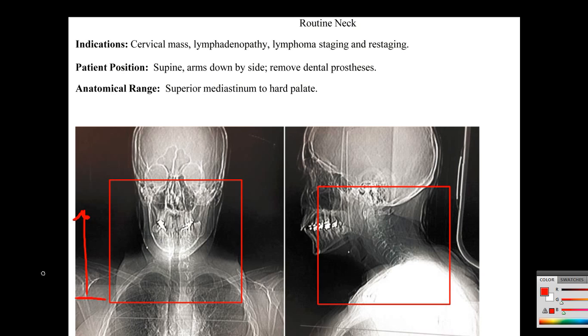The reason for this is because, as you'll remember, in the aortic arch, there are several bifurcations, and some of those bifurcations are the carotid arteries, which are going to supply the head and the face. And so it's essential that we catch the flow as it's going up, not coming from the head down, because we might potentially miss areas where the flow has not got to yet. So by doing this, we can ensure that we are actually getting the scan data correctly, and we're actually getting contrast enhancement as we should as we migrate towards the head.